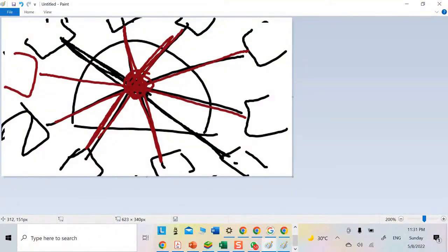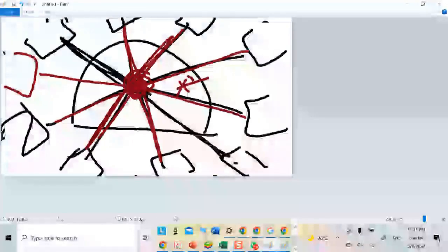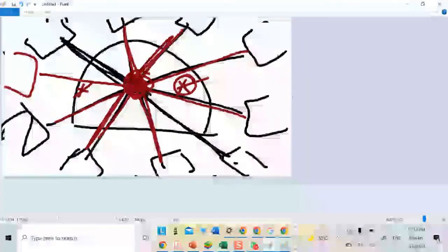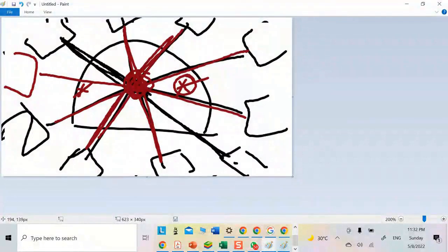If here, it will be the same story. This will be the very bright place. If here, this will be the very bright place. And it starts to identify the location of the annihilation. But there are problems because your resolution may not be high. Your resolution may not be high because it will definitely not be 100% accurate.